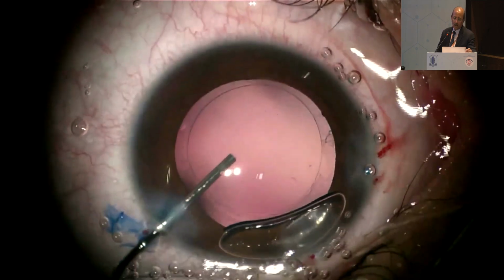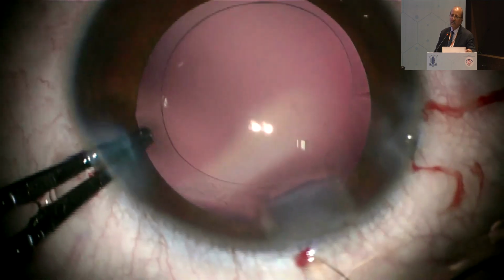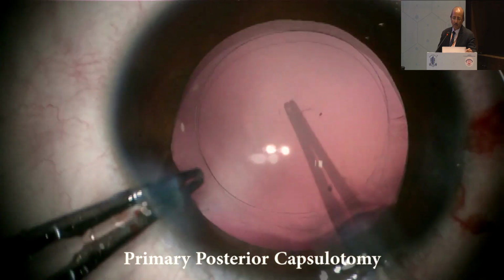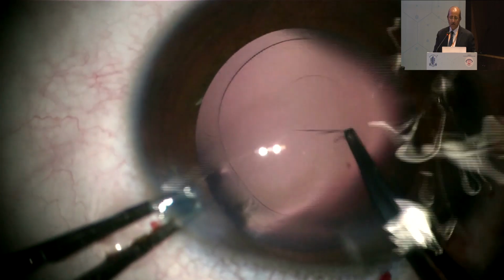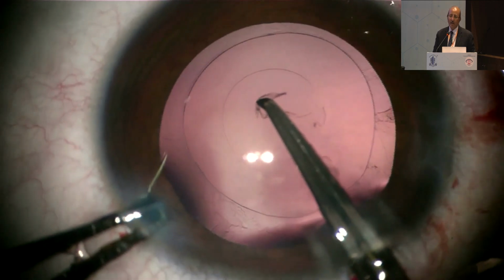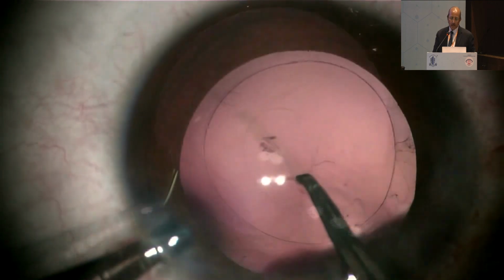Then usually in children less than 6 years, sometimes even less than 8 years, we make a primary posterior capsulotomy. The size of the primary posterior capsulotomy is kept around 3 to 3.5 millimeter. If you make it very large, it will be difficult for you to place the IOL.